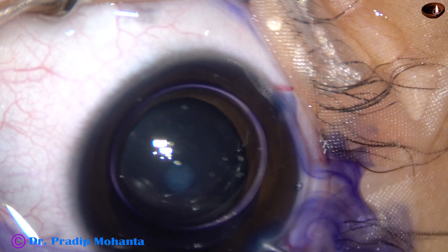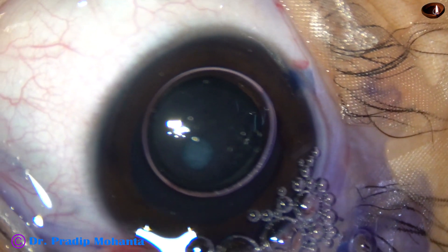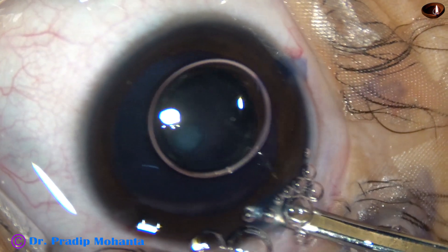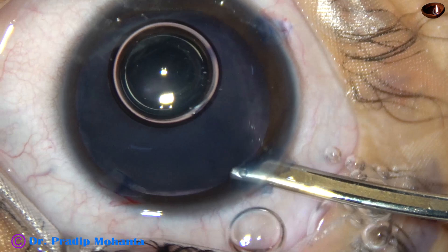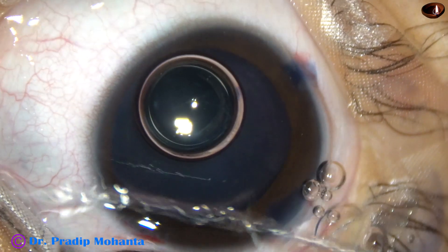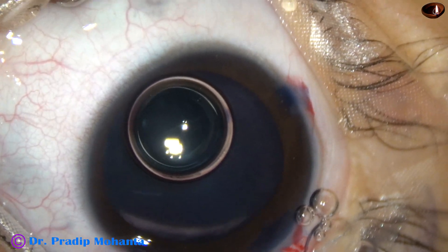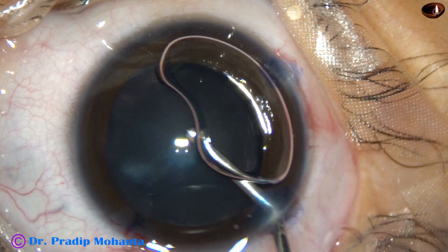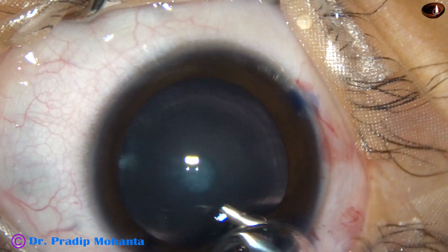Now I wash the dye out. This is adrenaline, and in this case adrenaline has worked very well. See, the pupil is dilating. Yes, it has dilated very well and this dilatation remained throughout the surgery. Now 2% HPMC is injected into the anterior chamber.